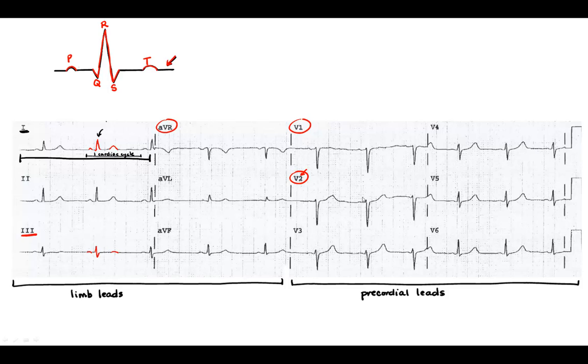You have your little hump, that's the P wave. You're missing your Q, but that's often the case in many of the leads. You have a small R wave, and you have a very, very deep S wave, and you have a very large T wave. But all of the elements are essentially there. And so thinking about distortions of the different elements helps you to see what's really there. Now for right now, let's not worry about these different variations in how the EKG tracing could look from lead to lead, but just know that the different patterns that exist are what tells a doctor whether the patient is healthy or not.